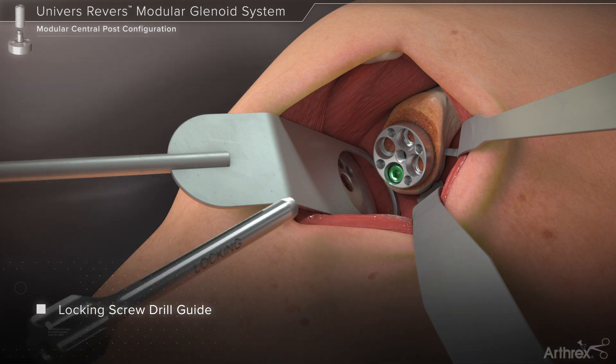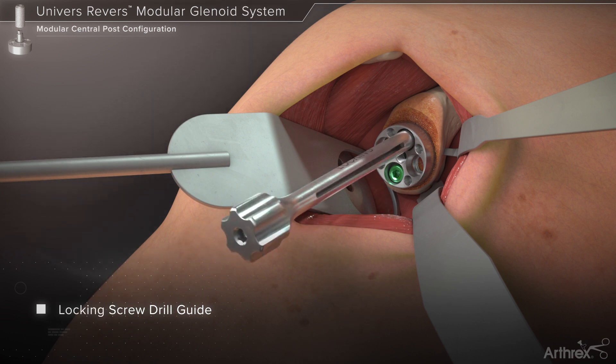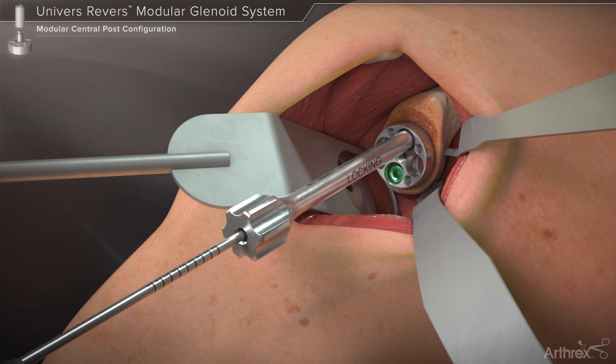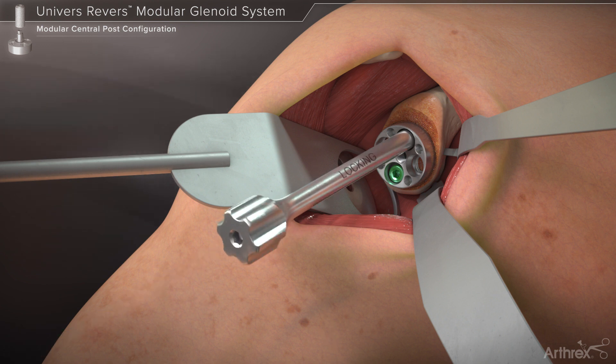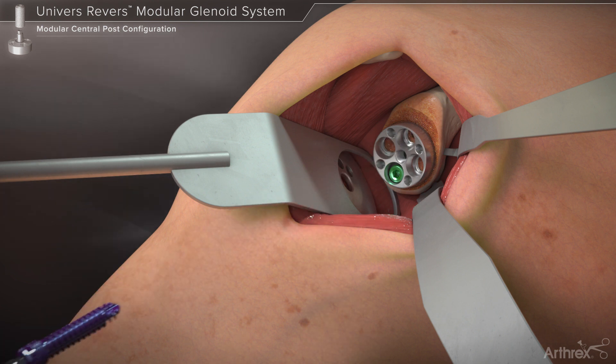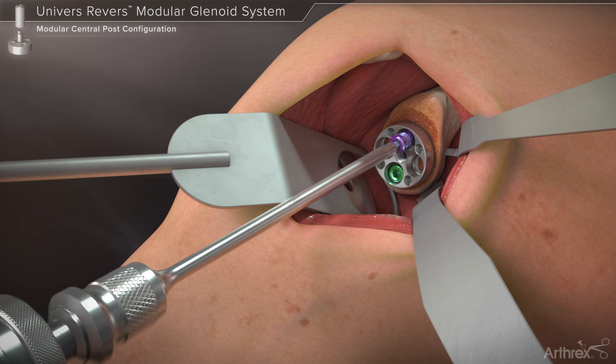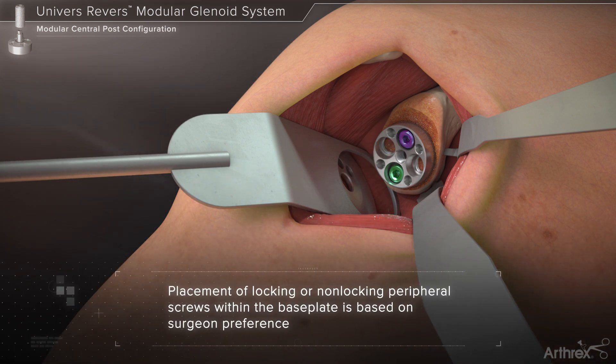For locking screws, thread the locking screw drill guide into the selected base plate hole. Note that on standard base plates, the orientation of the locking screws will be 10 degrees divergent from the central axis. The 3 mm drill is again used, followed by the hex driver to seat the screw. The use of locking or non-locking screws and their placement within the base plate is based on surgeon preference.